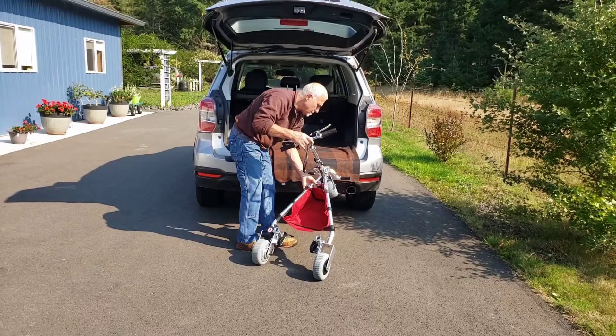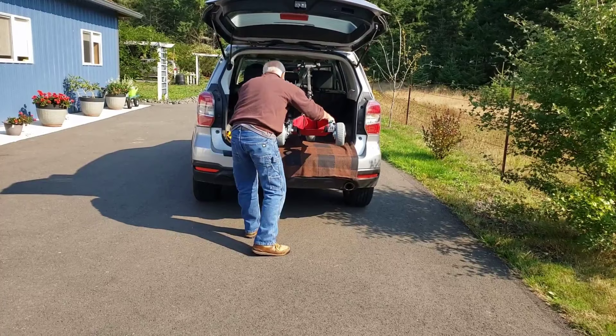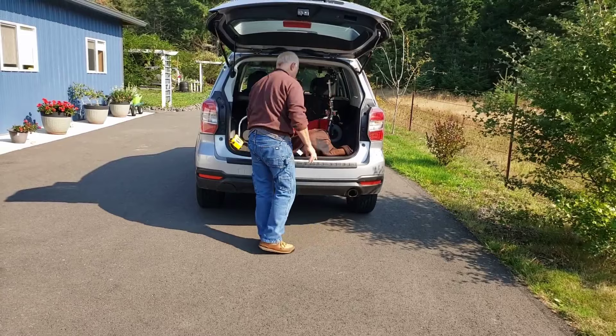You are lifting up just the front of the scooter. At no point are you lifting more than half the weight of the scooter. You have now loaded your TravelScoot without lifting more than essentially 13 pounds at any one time.